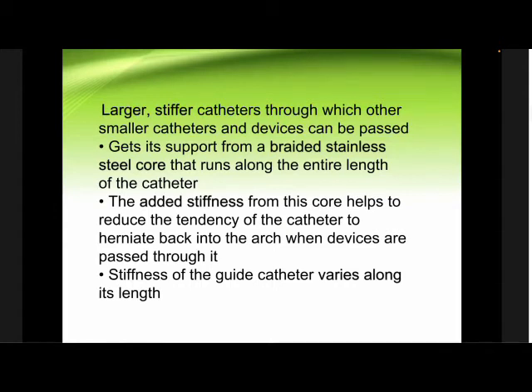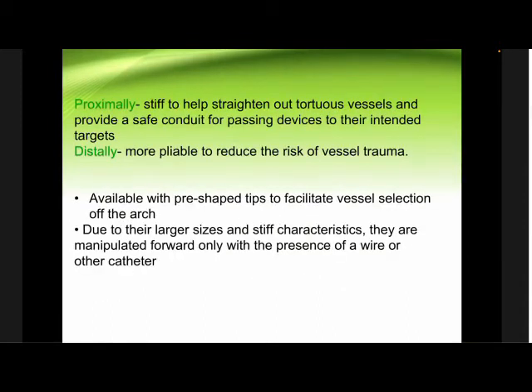The stiffness usually varies along the length. Proximally, it is usually stiff enough to straighten the tortuous vessel which it is traversing, and provides a conduit for passing devices through to their intended targets. Distally, they are more pliable to reduce the risk of vessel trauma and dissection.